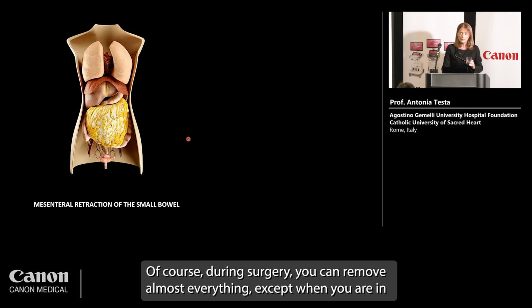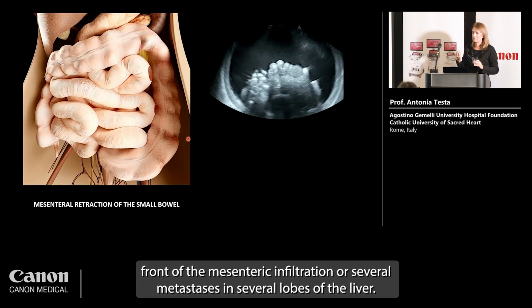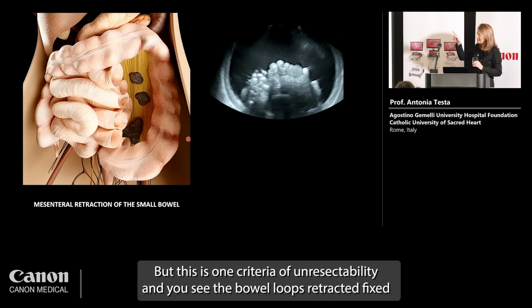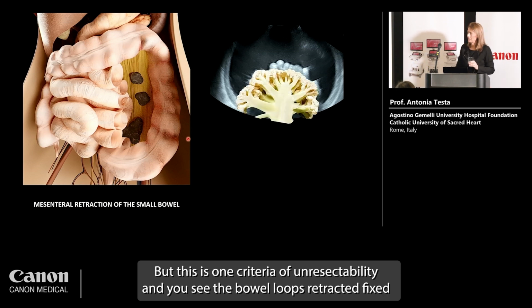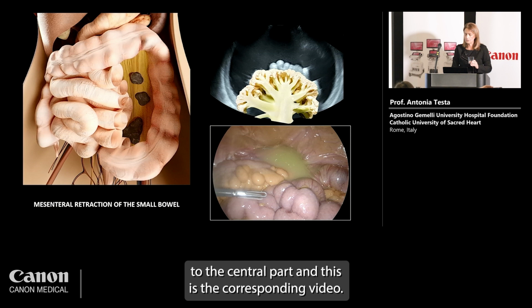Of course, during surgery, you can remove almost everything except when you are in front of the mesenterial infiltration or several metastases in several lobes of the liver. But this is one criteria of unresectability. And you see the bowel loops retracted, fixed to the central part. And this is the corresponding video.